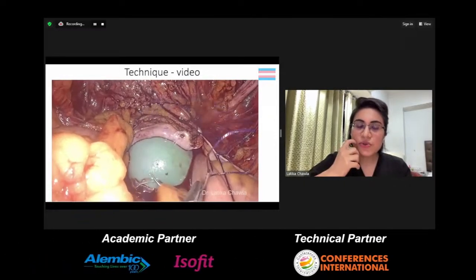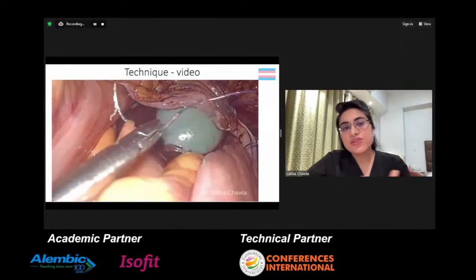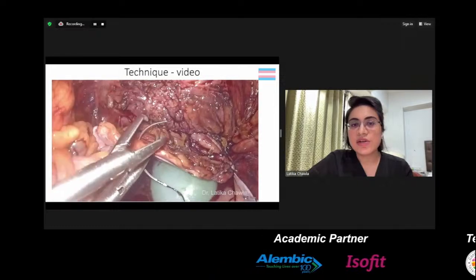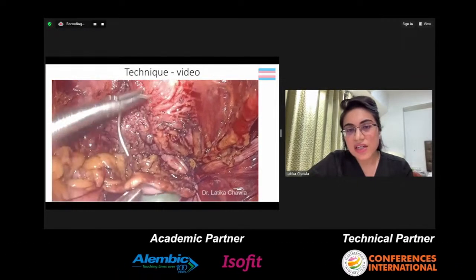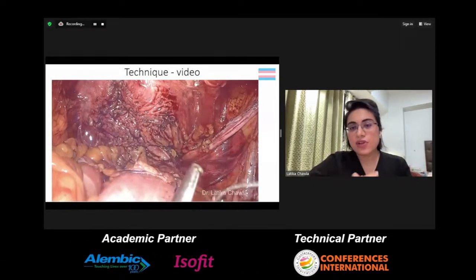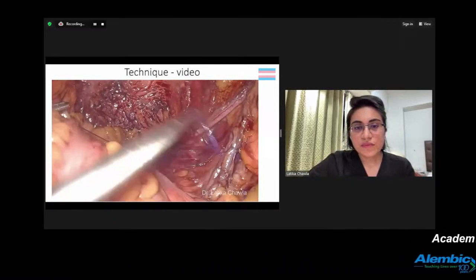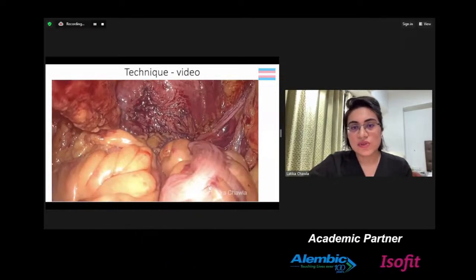Now, initially, when we started doing these surgeries, we were placing Interceed to cover all this raw area that is left behind when the peritoneum is cut off. But later on, we realized that the peritoneum really grows very fast. And after that, in the last few surgeries, we've not left any adhesion barriers. Though I want to say that we have not gone back to really see whether any adhesions have happened or not. So that still remains controversial at this point. So once we close the cavity, this is how it looks.